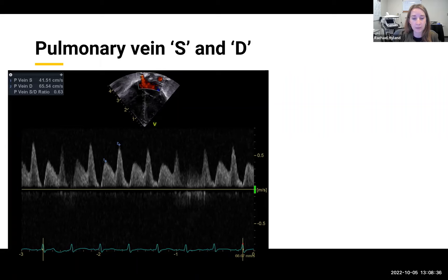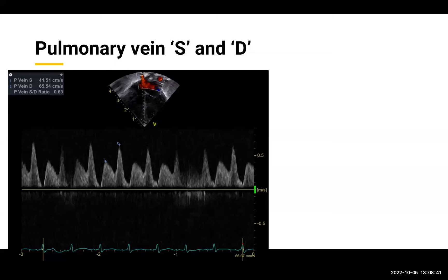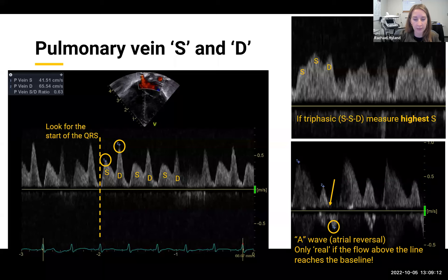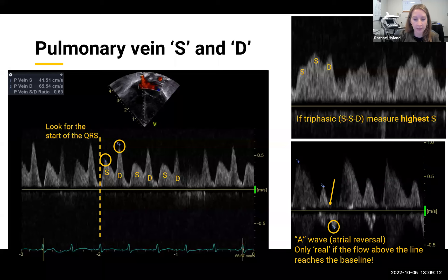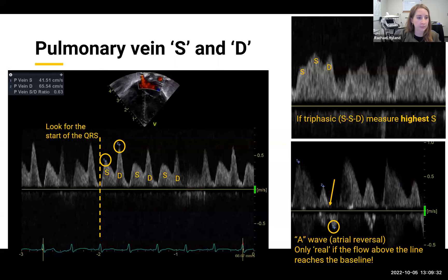The first measurement is the tracing of the pulmonary vein from the apical four-chamber view, usually showing a systolic S wave and a diastolic D wave. Sometimes you'll see triphasic flow with an S, S, and D — in that case, measure the higher of the two S waves. To do this measurement, look for the start of the QRS, the S should follow just after, and mark the peak velocity of the S wave and D wave. An A wave can be present showing atrial reversal — this can be normal or a marker of LA hypertension, but it's only a real A wave if you see the D wave coming all the way back to baseline first.